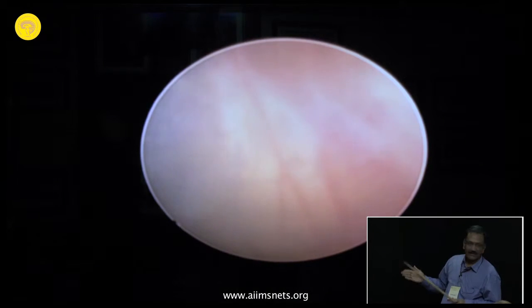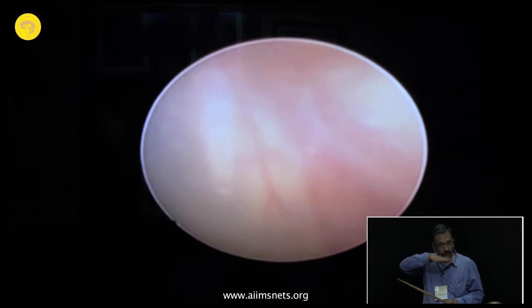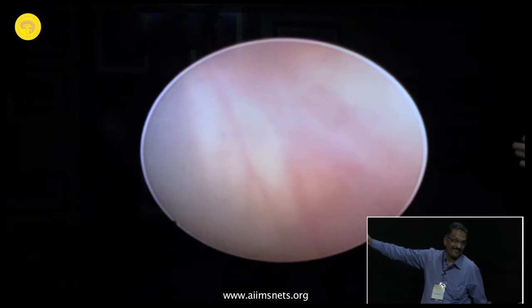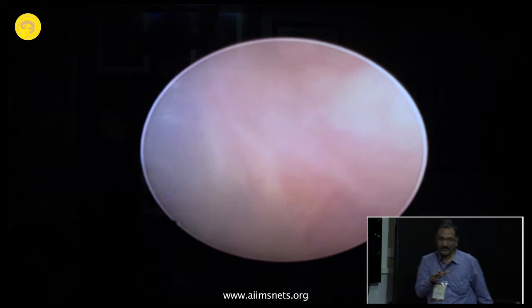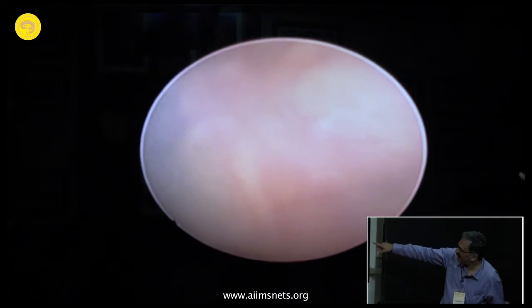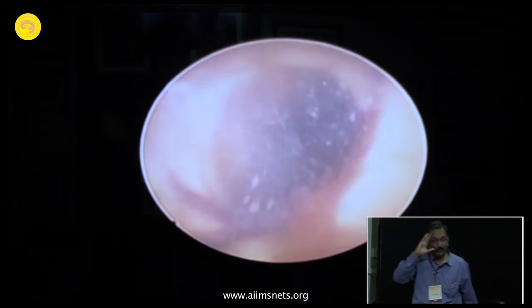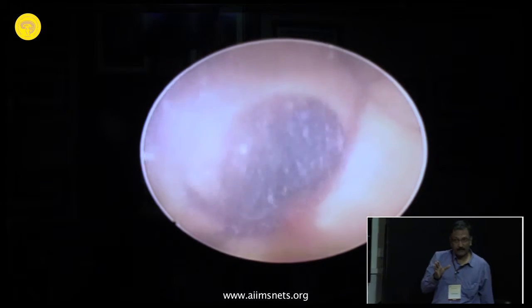And here what happened was that the endoscope had actually gone through a thin, flimsy wall at the bottom, and we had reached up to the subarachnoid space there. So you have to be very careful about your depth perception here. You understand? There was no fenestration made. It was a spontaneous fenestration. When the haze clears up a little while you are irrigating, you can see all the vessels there. So this is one important thing you need to look at: your depth perception.